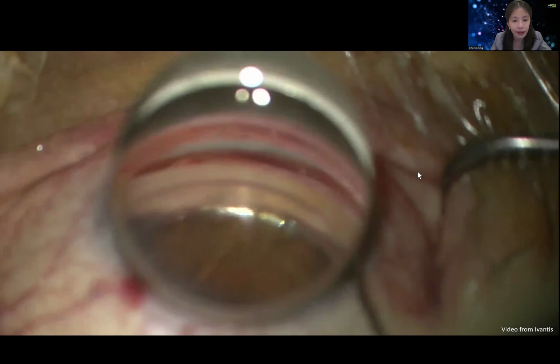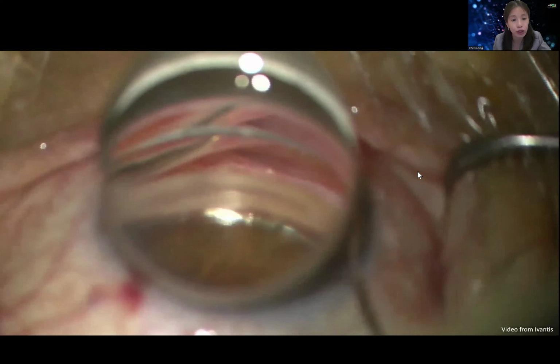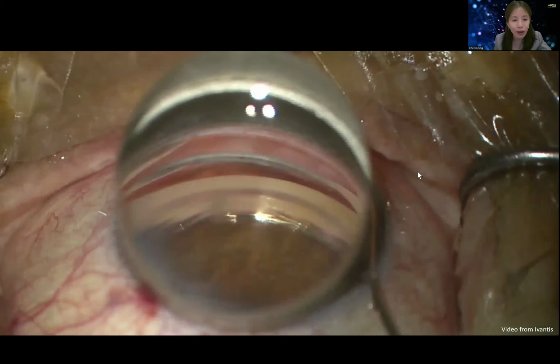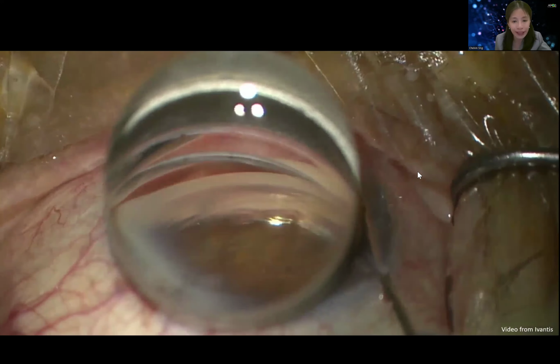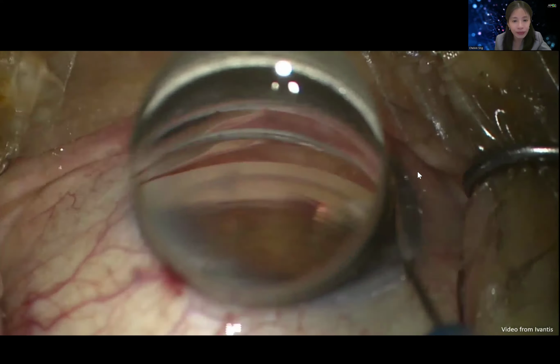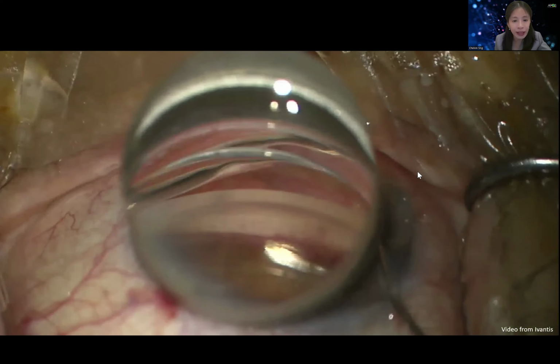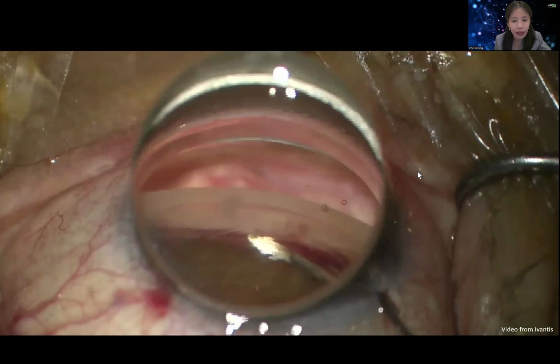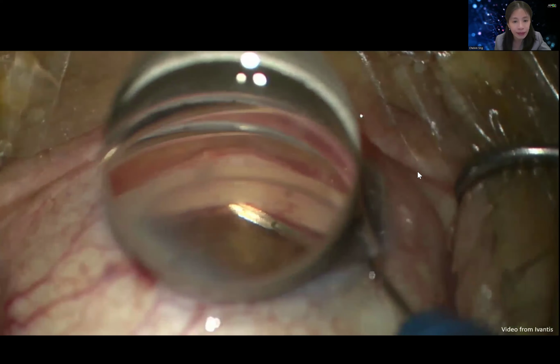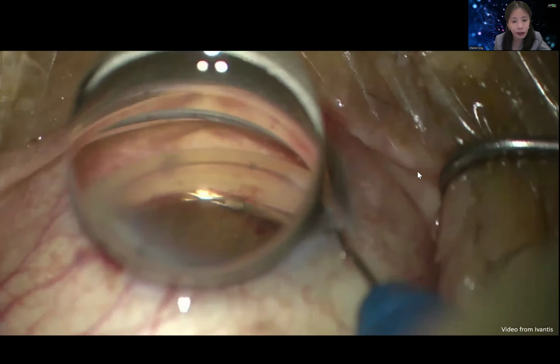If the Hydrus is not inserted well, for example, if it dips posteriorly into the suprachoroidal space, remove the implant. As shown earlier, it is important to practice reloading the implant with the injector. After removing the Hydrus, then pierce the trabecular meshwork a bit downstream of the initial intent. And now it goes in very smoothly.